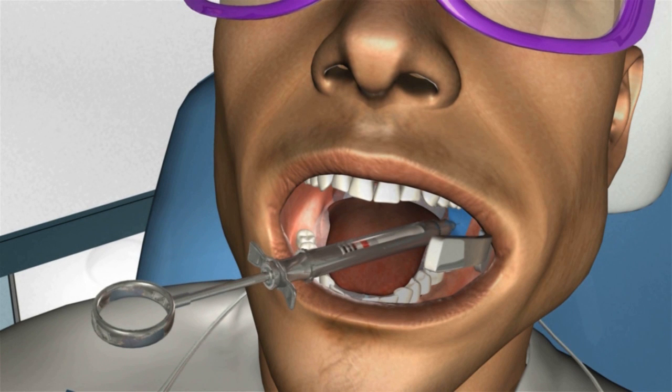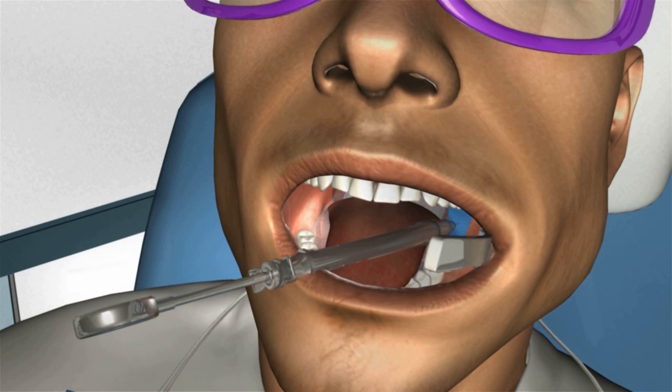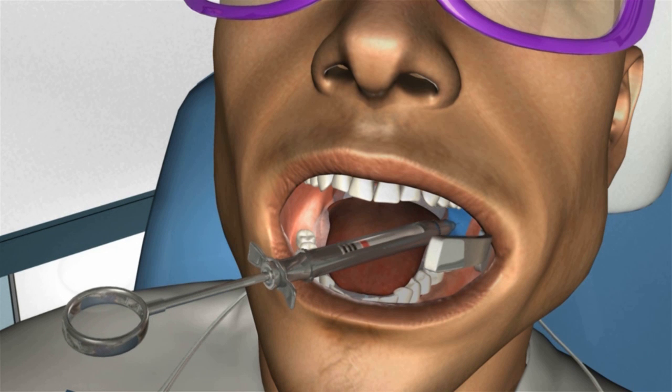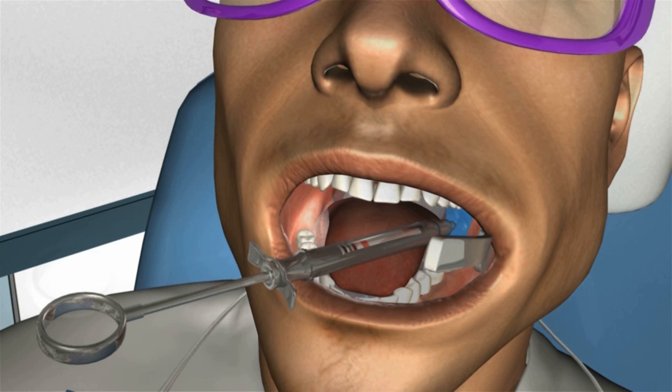Once you have made contact with the ramus, back out 1 millimeter or so, and begin your aspiration sequence. Aspirate, rotate the syringe slightly. Aspirate, rotate the syringe back to the original position, and aspirate a final time. If all 3 aspiration tests are negative, you may begin to deposit your anesthetic solution. If there is a positive aspiration and blood is seen within your anesthetic carpule, withdraw and recap your needle, and replace the carpule with a fresh carpule.